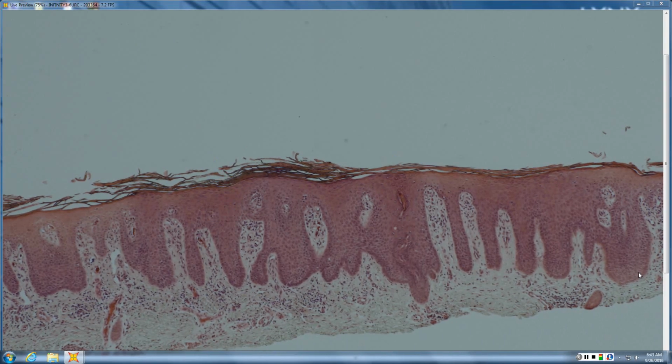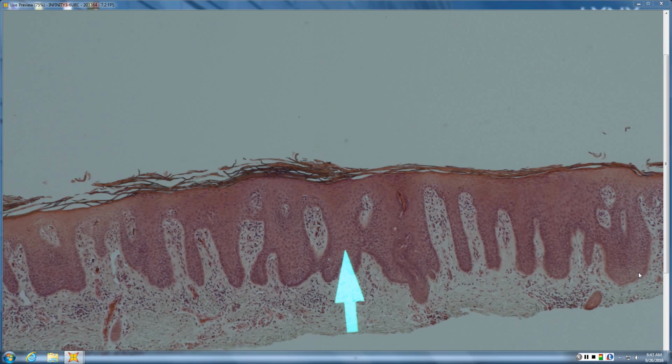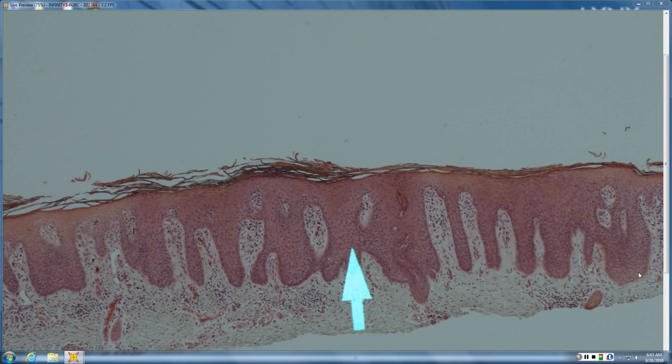You really don't see a whole lot of spongiosis in the acanthosis in the epidermis itself. Maybe a little bit here and there, and of course, Elston loves to ask, what are the types of psoriasis that you get more spongiotic changes to the epidermis, since that's classically going to be acral, inverse, erythrodermic, stuff like that. So you can see some spongiosis, but generally speaking, hardly any. You don't see much of an infiltrate, so that's very important. With psoriasis, you should just see a little bit here and there, a perivascular, subtle lymphocytic infiltrate, but certainly not a pronounced infiltrate.